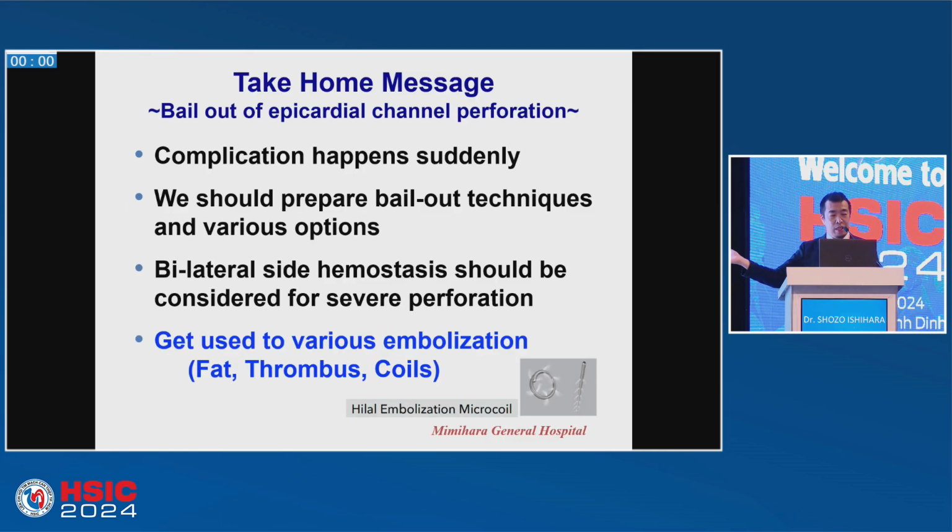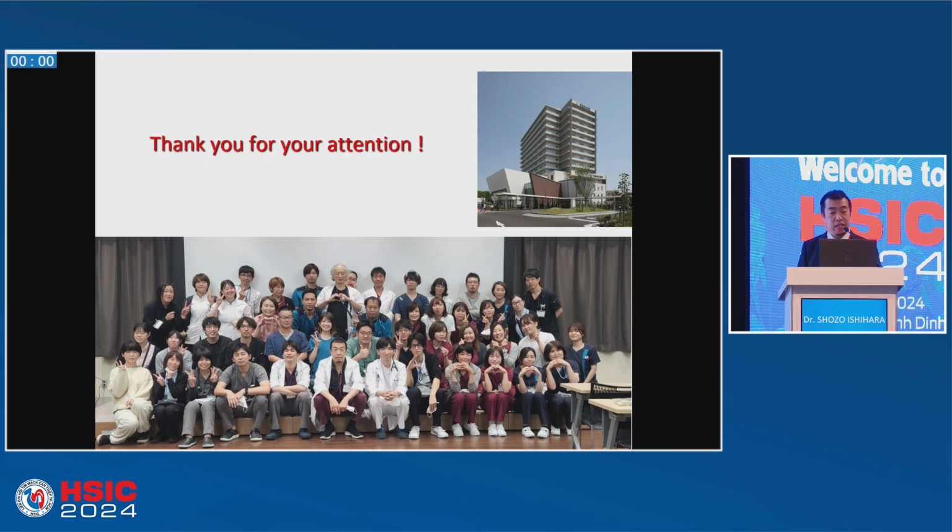So this is the last slide. Complications happen suddenly, and we should prepare bailout techniques and various options. And bilateral side hemostasis should be considered for severe perforation, and get used to various embolization. Thank you for your attention.